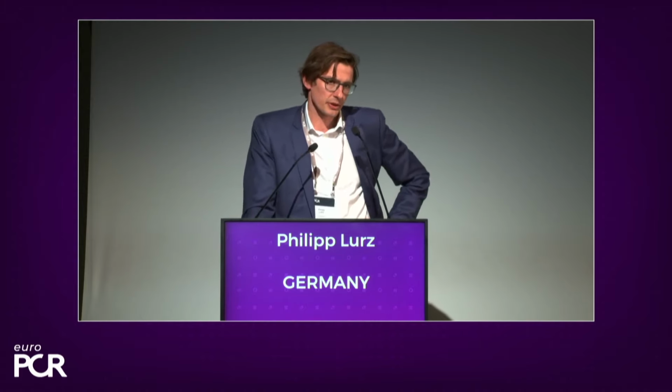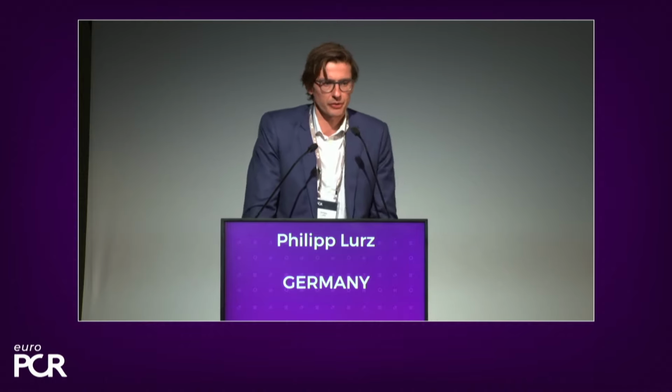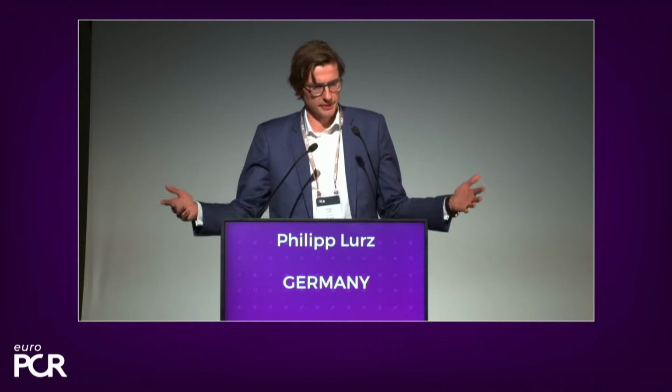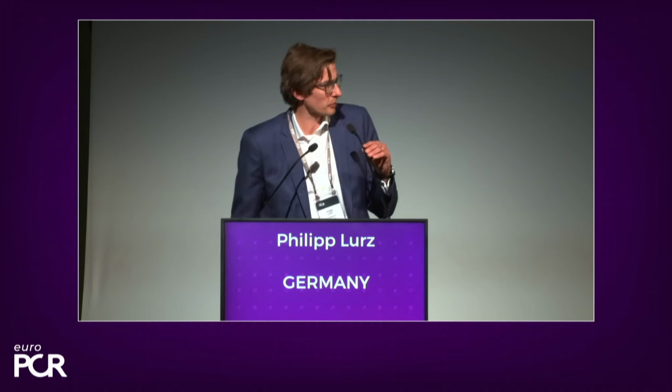And you could also see that although we had a sort of acceptable or even good result with the first grasp, we thought that it's important not only to look for color, but also for the anatomy and see whether there is still prolapsing or flail tissue left, and that's why we moved more medially. Any other comments before we continue?